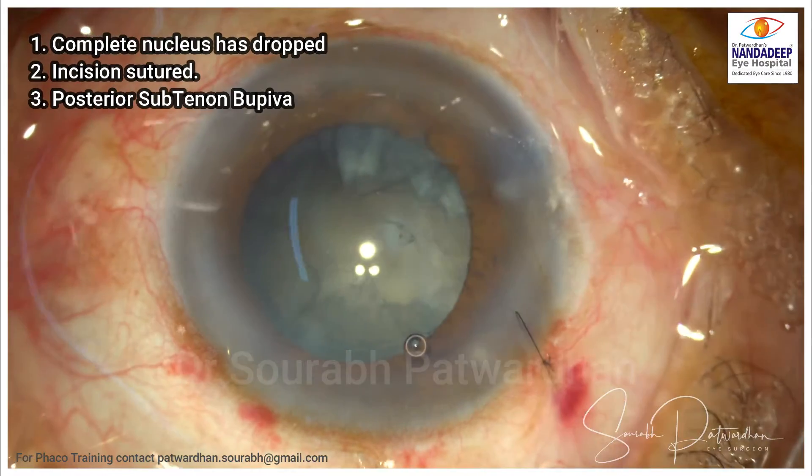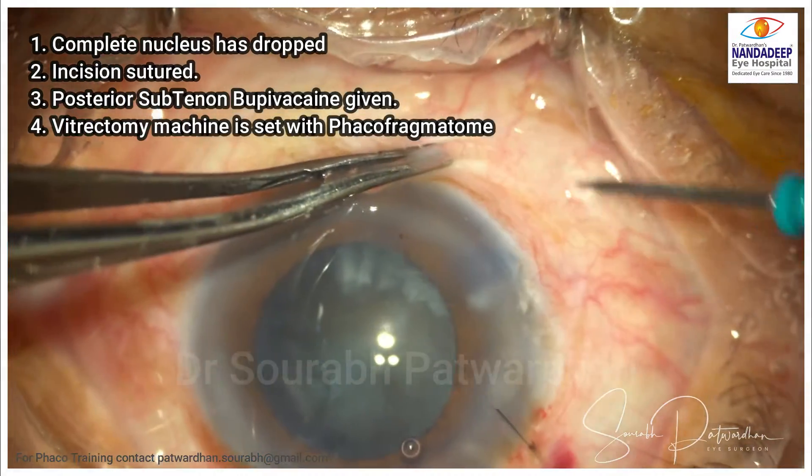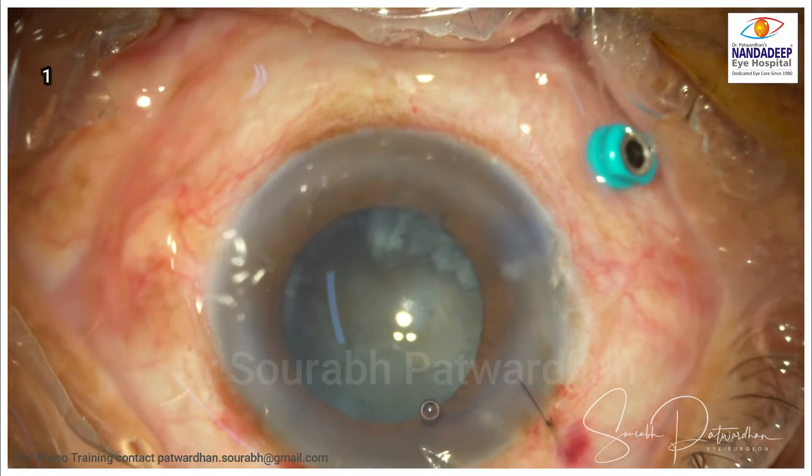In this case, complete nucleus has dropped. The incision has been sutured by the anterior segment surgeon, which is great. Anesthesia has been augmented with bupivacaine.